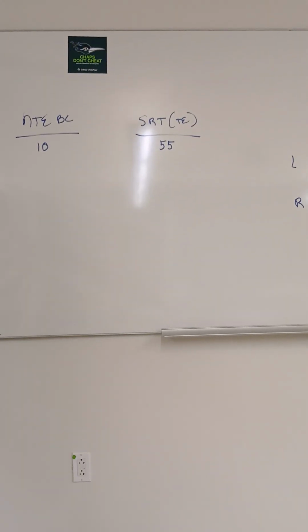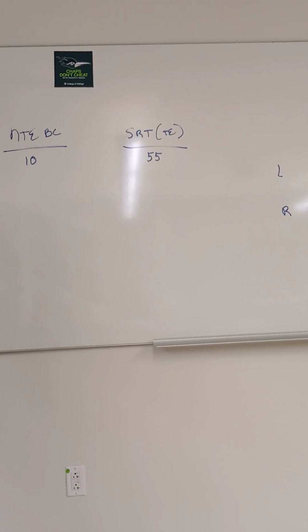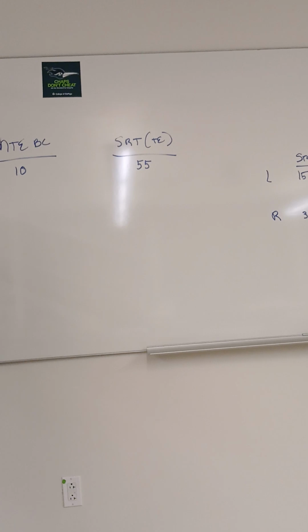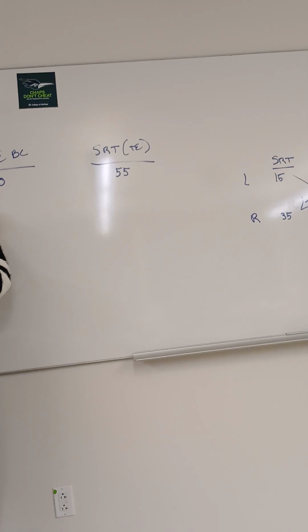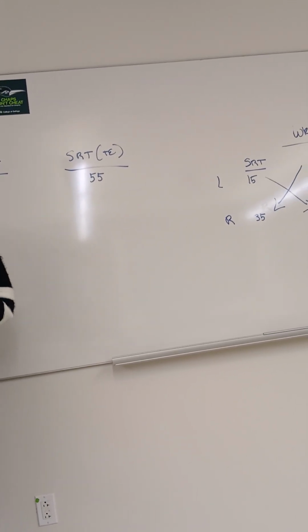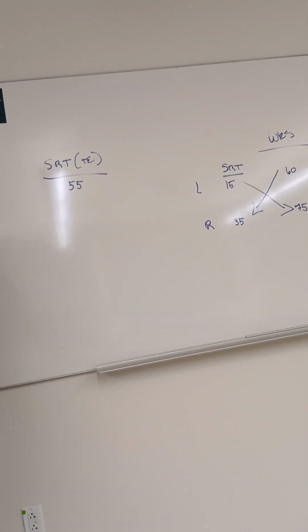Do we need a mask for SRT? Where are you using headphones, did you say? Yes. Okay. So now the SRT of our non-test ear equals 20.